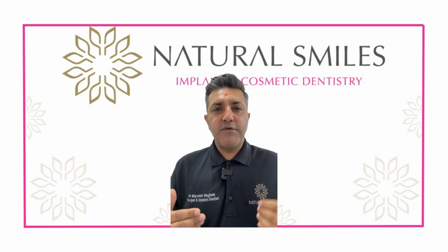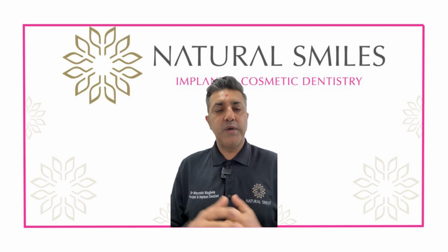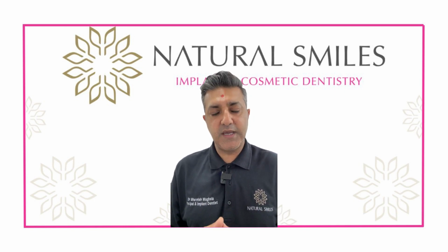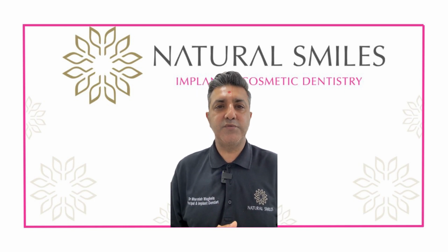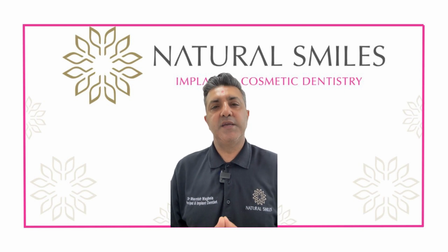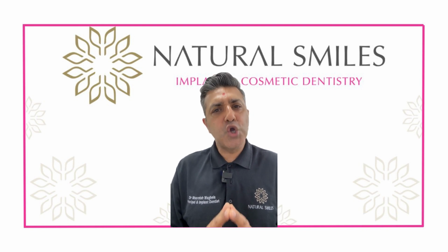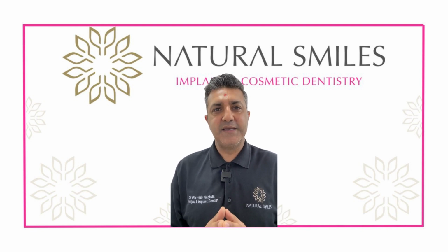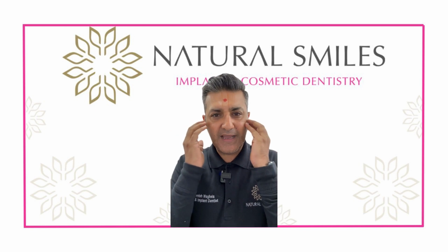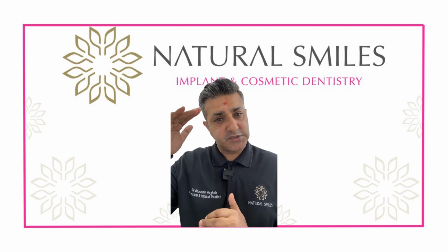Then the scenario is we have patients that have no bone. So we obviously have to replace that bone, and there are a number of ways we can replace missing bone using bone grafting materials and bone grafting techniques. The most common area where we find that there is a lack of bone is towards the back of the mouth, because sometimes when teeth are removed, the bone starts to shrink.